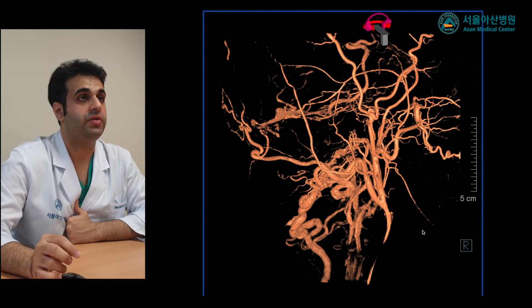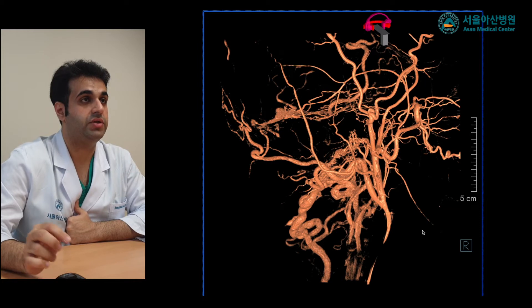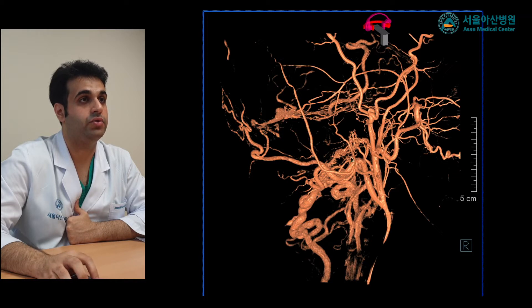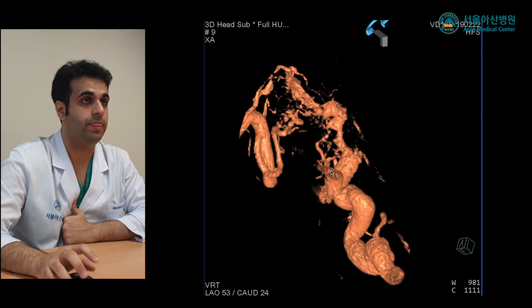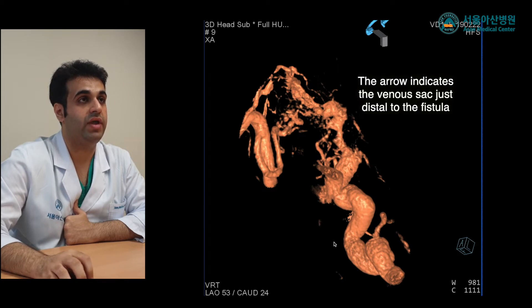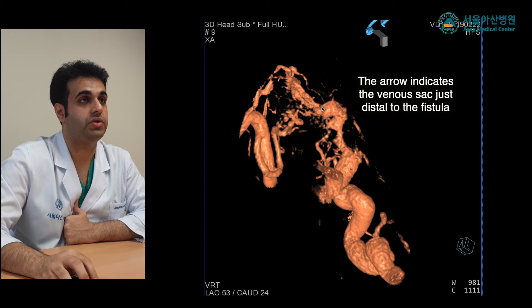This is the 3D reconstruction image. It demonstrates two dural AV fistulas at the lateral sinus and the posterior condylar vein. This is a magnification view of the posterior condylar vein, which demonstrates the fistula point.